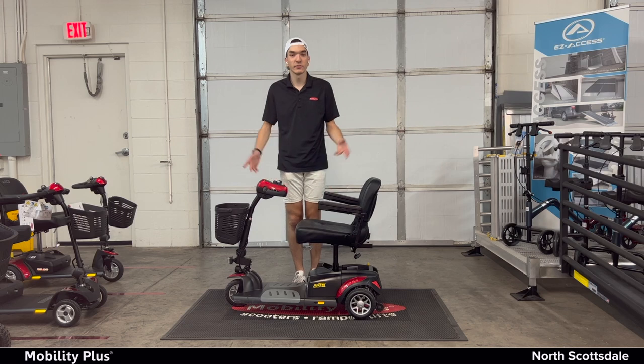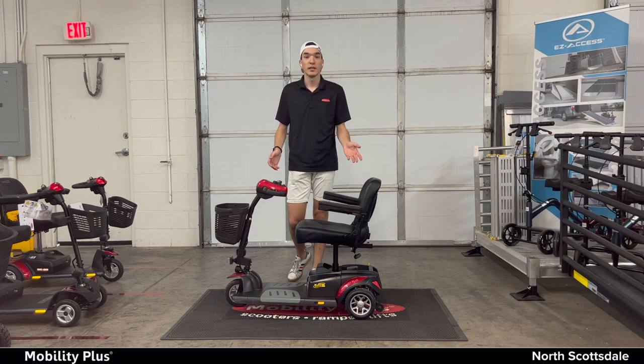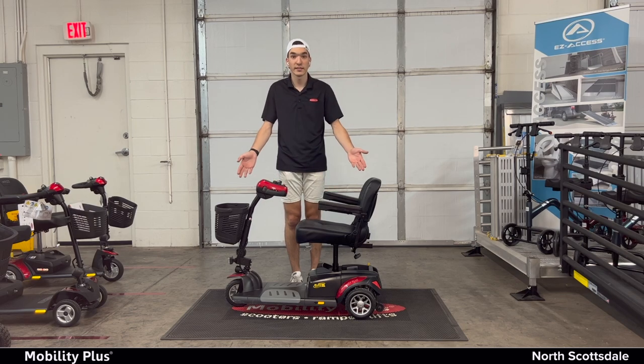Hello, thank you for choosing to rent with Mobility Plus North Scottsdale. You have rented the Golden Foes Around XL and we are going to show you in this instructional video how to assemble it and disassemble it in five easy steps. So without further ado, let's get started.